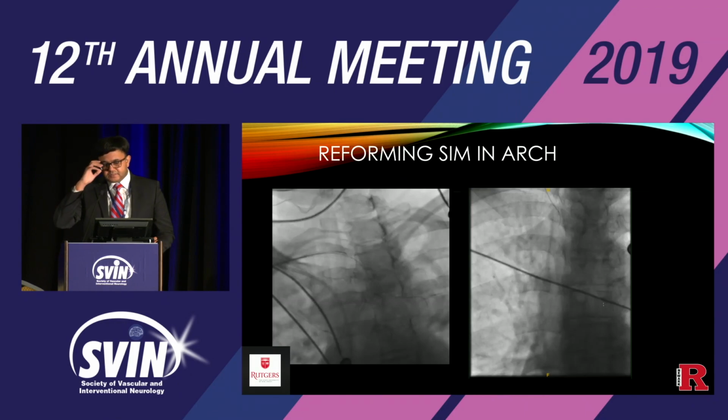So again, Rakesh has showed this video already. The easy way to form it is in the descending arch. You put the wire, the catheter goes into the descending, then you pull back the wire so that the catheter can retain its secondary shape. You kind of twist and push. That's the trick here. And then it goes nicely, your catheter is formed.